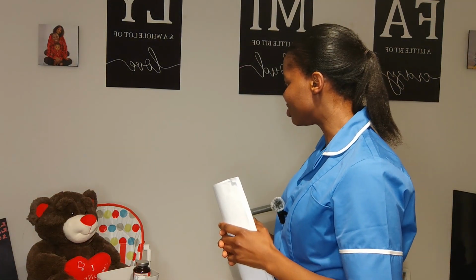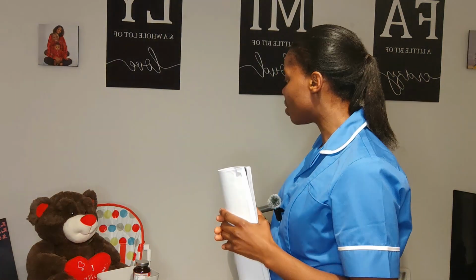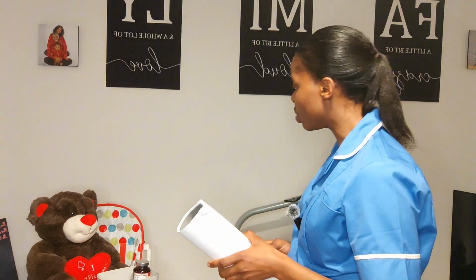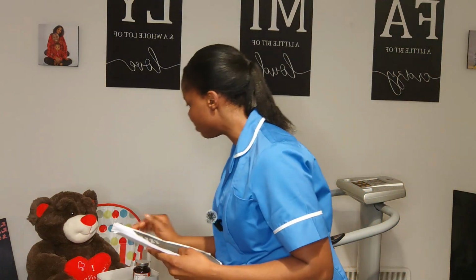My hands are clean and I allow them to air dry for 30 seconds as I approach my patient. Hello, I'm Kenny, one of the nurses that will be attending to you today. How are you? The reason why I'm here is the doctor has ordered your inhaled medication be administered in order to facilitate proper breathing for you. Is it a convenient time to do that, please? All right, thank you very much. Before we continue, could you please confirm your full name and date of birth while I double check with my paperwork as well as against your wristband, please?